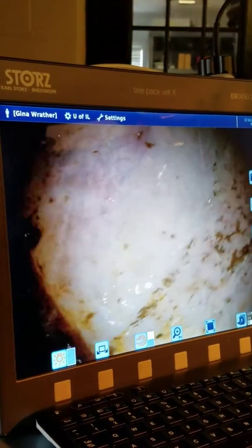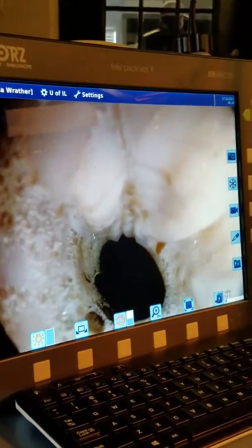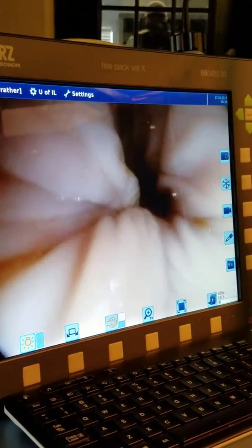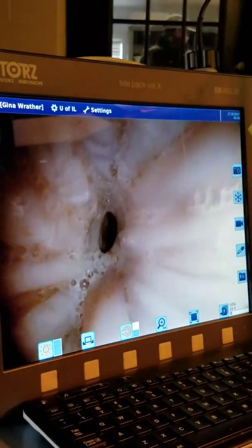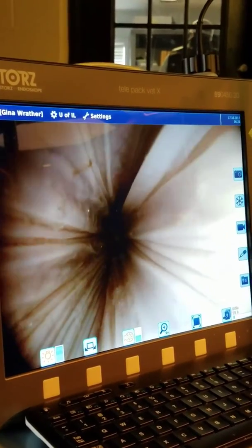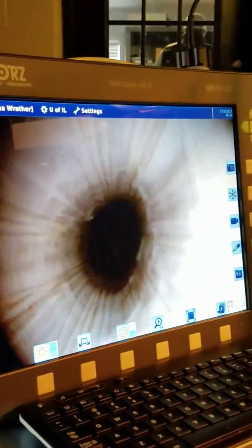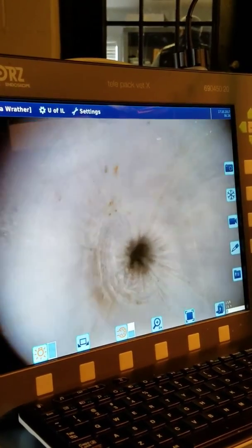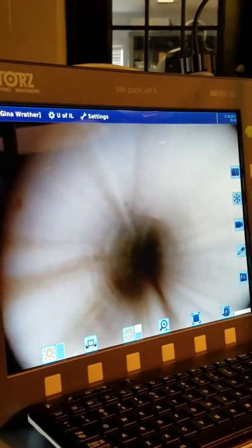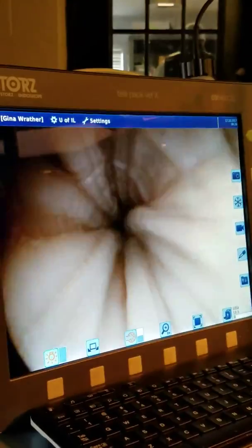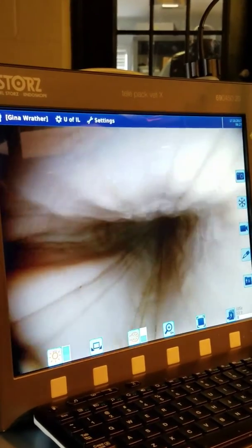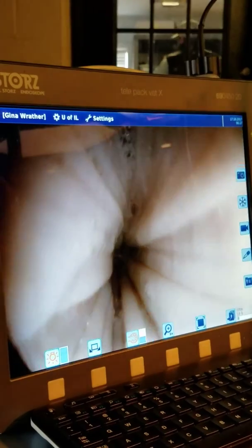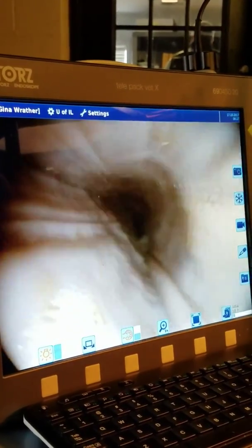Let's come out slowly and take a look at his esophagus. That all looks really good — and this would be even before the area where he was choked. That whole area where the choke was found looks really normal. I think you got him there fast enough before he bruised or damaged his esophagus. Sometimes they're just kind of loose chokes, maybe even up higher mid-esophagus, and when you put the tube in it just shoves it down to a stopping point. But it does like to get hung up right before it gets to the stomach.